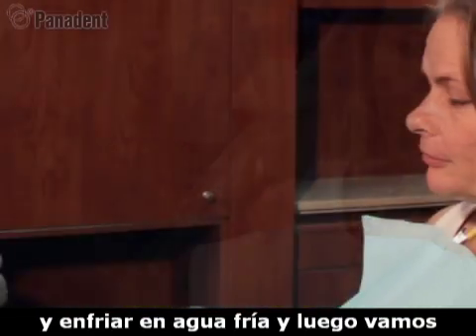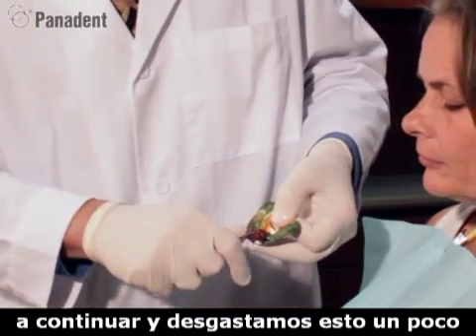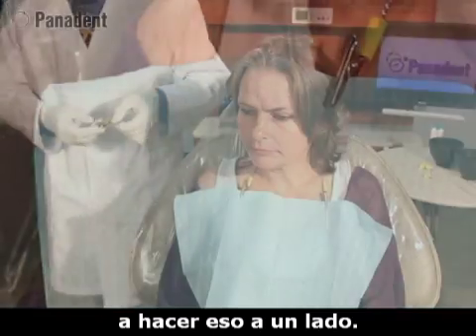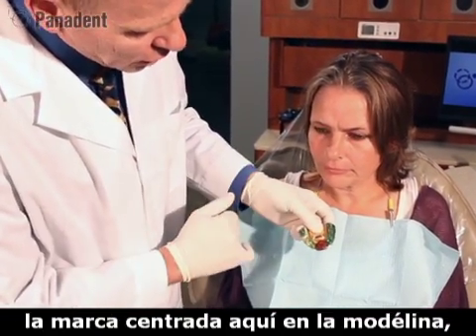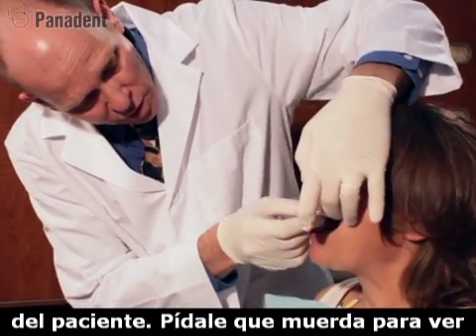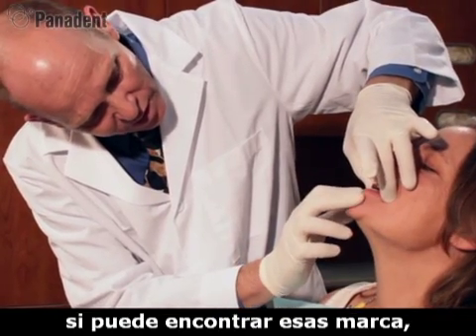We're going to go ahead and chill that in cold water. Then we'll actually go ahead and shave this back a little bit, just getting the index of those teeth. So I'm going to do that on the side. So now you can see we have the centric index here in the compound. Again, we'll try it back in the patient's mouth. We'll have them bite to see if they can find that index.